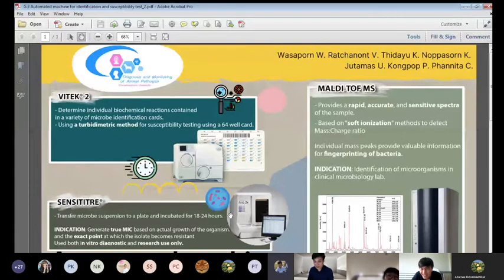I have a question about the, my name is Chananiki Thanwat from Group 4, and I just want to ask why you would say that MALDI-TOF is the most expensive, or the most cost of the clinical sample, or are you talking about the whole equipment? Because for each sample it may be cheaper. Anything that you can explain about this infographic?